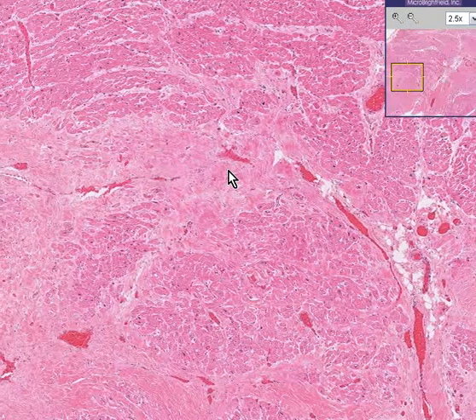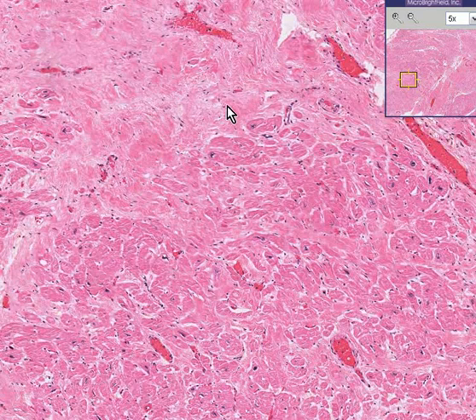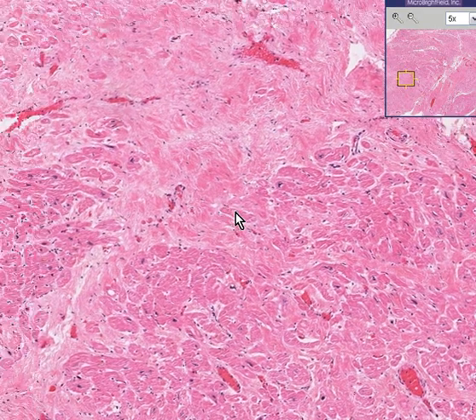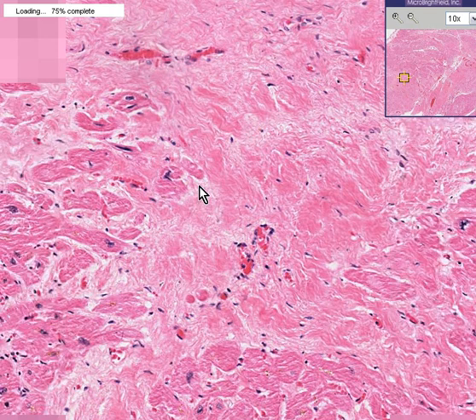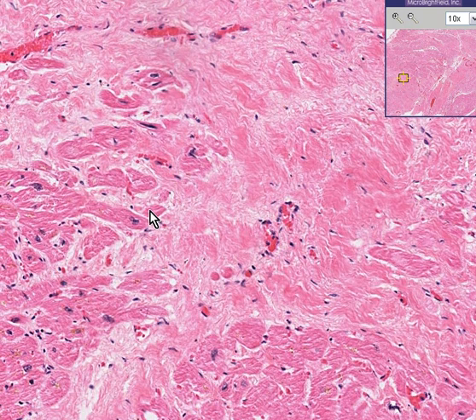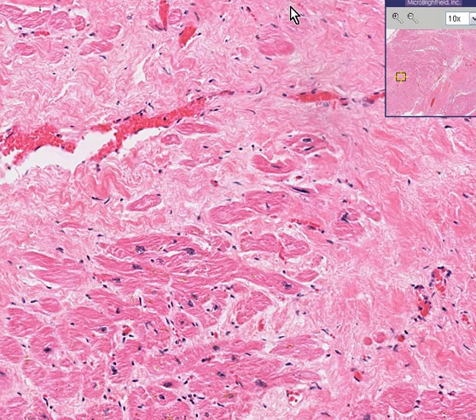this is a scar. And I think one thing that you can also notice is that this scar tissue tends to choke off or compress some of the cardiac muscle fibers. I think I could convince you in this picture that whereas most of the tissue here are fibroblasts and scar tissue, you could see some remnants perhaps of cardiac muscle fibers which are surrounded by the scar tissue. I would venture to say this is scar tissue and this is a sclerosed or choked off muscle fiber.